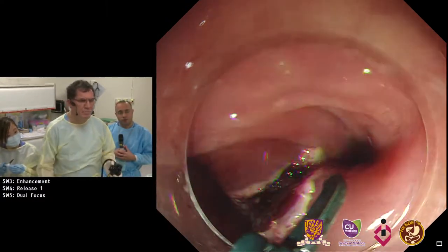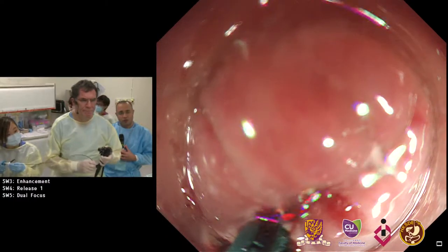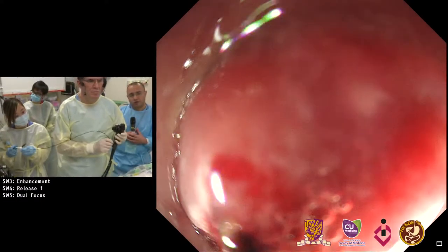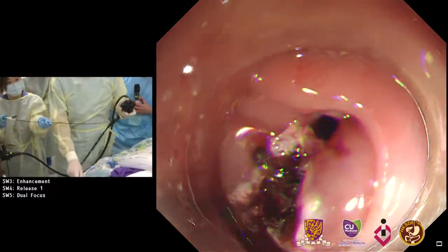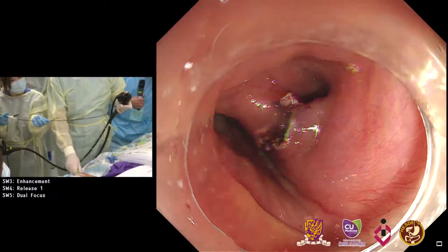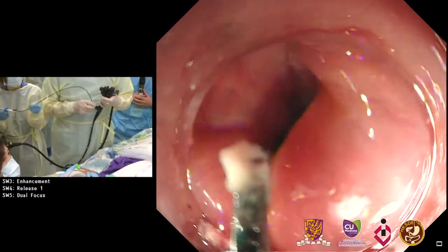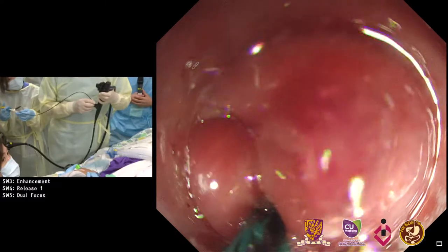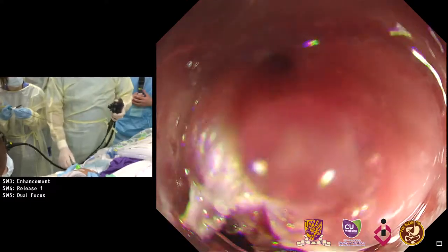It looks like you're getting through the mucosa there. Bleeding is one of the risks with this procedure, both during and delayed. Before using the SB knife, the IT knife works very well here — it has a long shaft so it's efficient, and with the insulated tip you protect the esophageal wall on the opposite side.